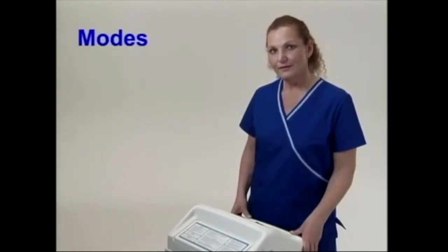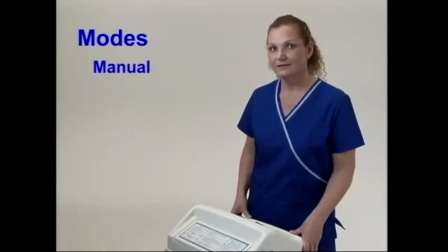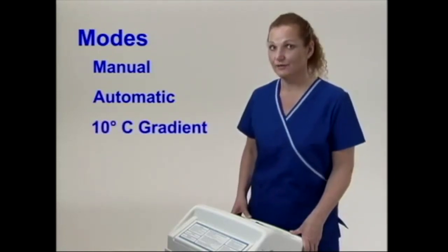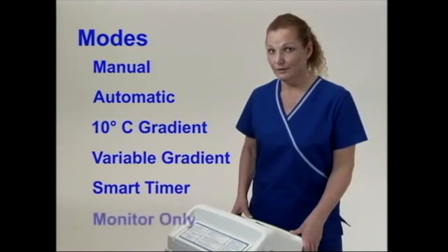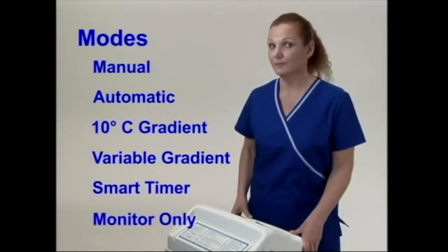For this segment, we are going to review the manual mode, the automatic mode, the 10 degree gradient, the gradient variable mode, the smart mode, and the monitor only mode of the Blanketrol 3.